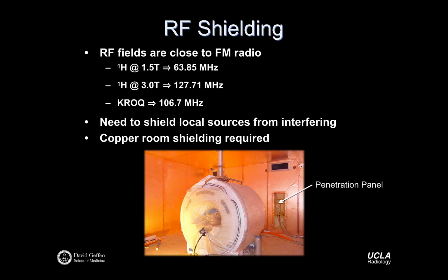Well, we talked about this, probably in the second lecture, where we can copper clad the entire room, building a so-called Faraday cage, so that stray electromagnetic radiation is effectively trapped by this Faraday cage. And yet, we still need to be able to get certain signals in and out of the MR room, right? We have to get the gradient currents in and out of that room. Otherwise, we have to put a giant gradient amplifier inside this room, and it generates EM that gets into our coil. So we try to keep almost everything outside of the room and then pipe it in appropriately.